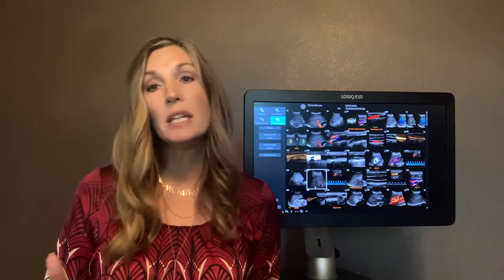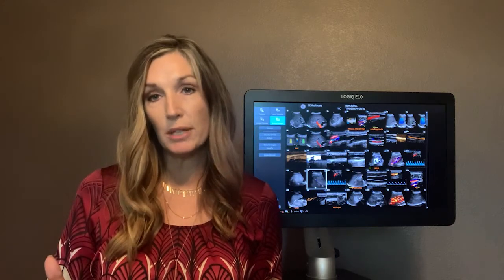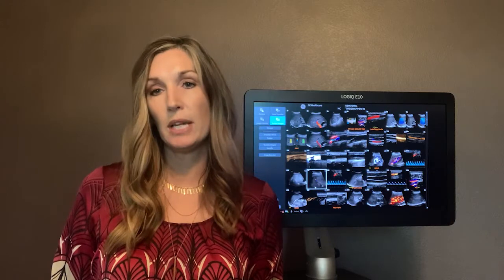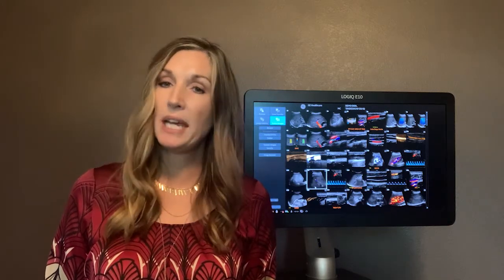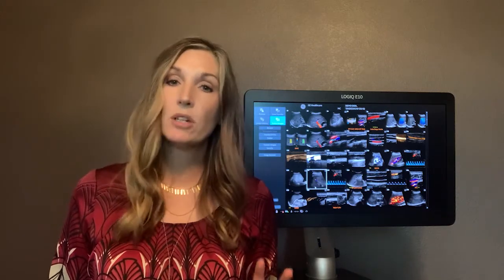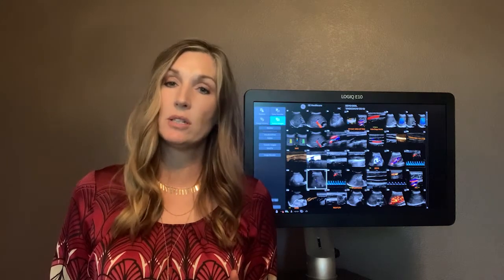In today's environment, we acknowledge the challenges many of our healthcare heroes have faced during the pandemic. Clinicians need robust ultrasound tools that enable productive patient-centered care across a wide range of clinical scenarios and applications.